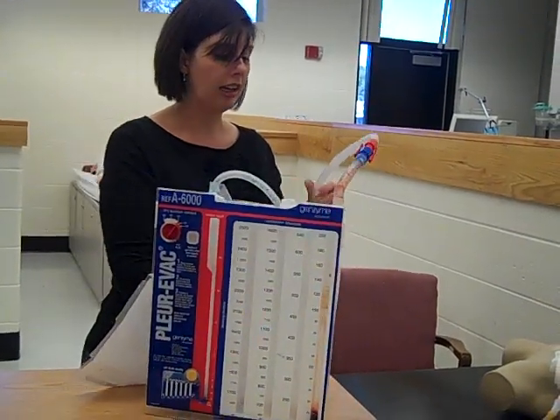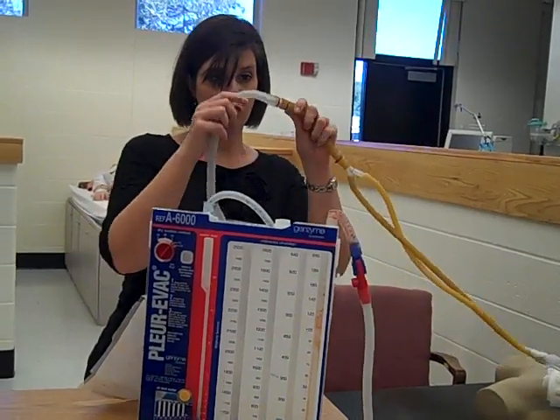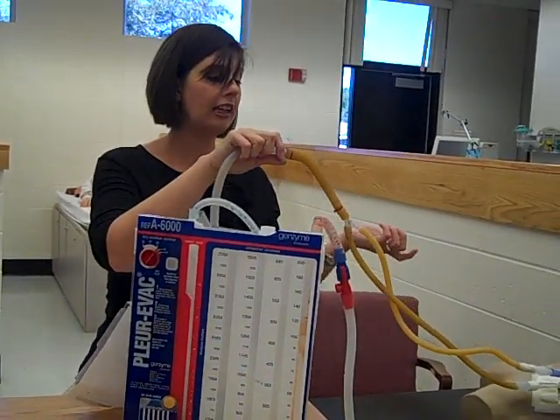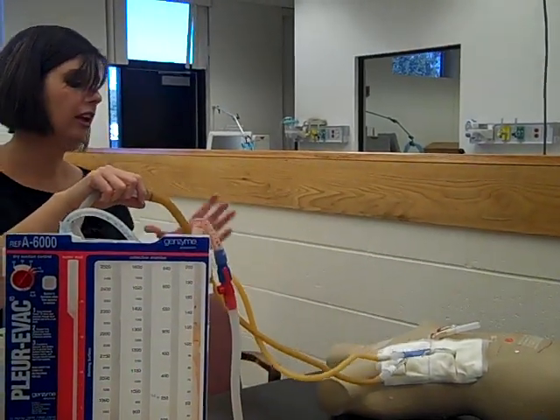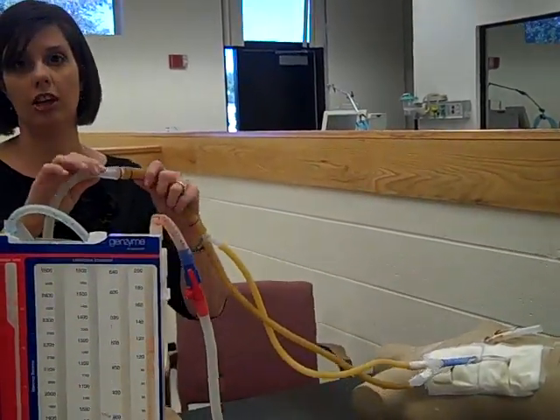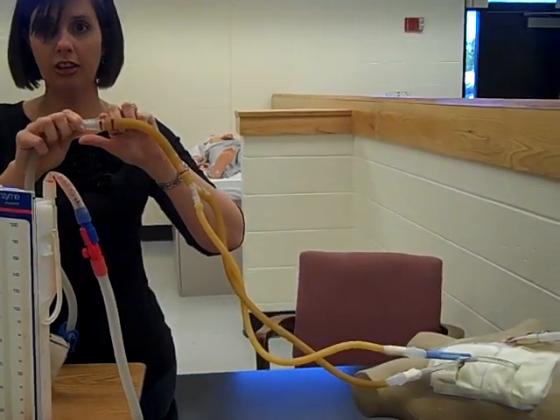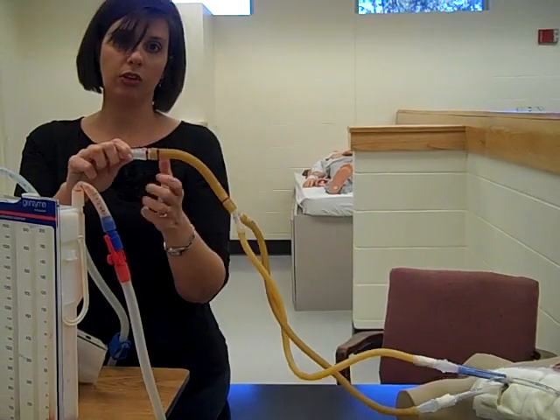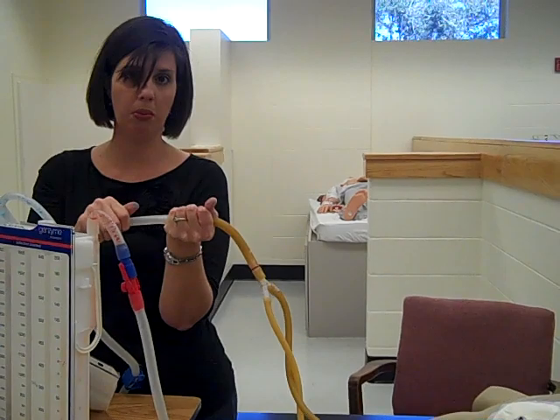The physician will insert the chest tube, as we will go over in class. And when he is all done and ready, you will take your end of the chest tube, which is here, and he will take his end of the chest tube, which for this particular setup is here because it has an extension looping. If it didn't have this, then this part here would go directly to your chest tube in the patient. You will put them together and secure them with either commercial ties, as demonstrated here, or silk tape to make sure the connection is tight and firm and that they're not going to accidentally pull apart.